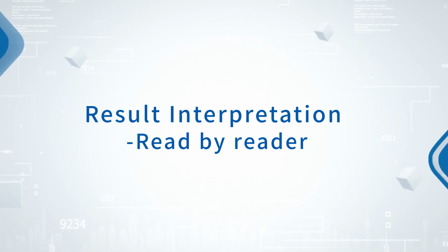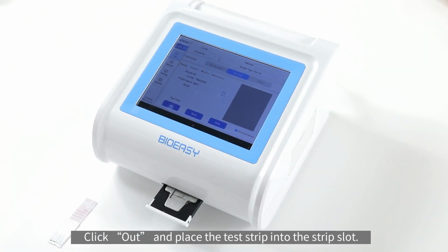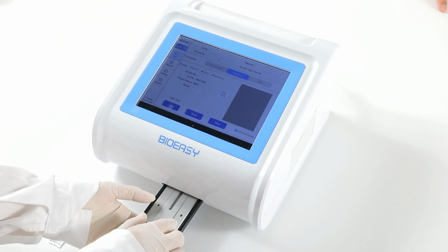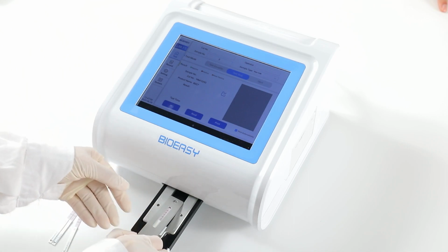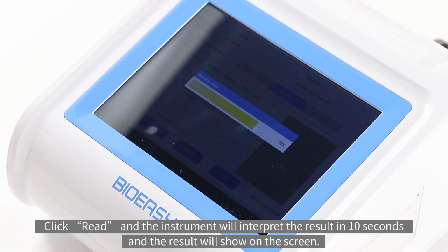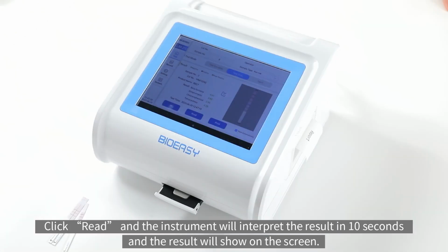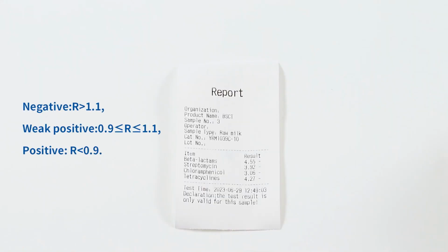Result interpretation. Read by reader. Click out and place the test strip into the strip slot. Click read and the instrument will interpret the result in 10 seconds and the result will show on the screen. If print automatically is checked, the result report will be printed automatically.